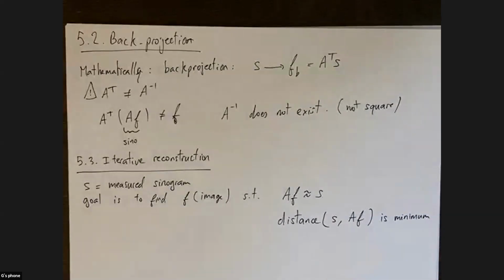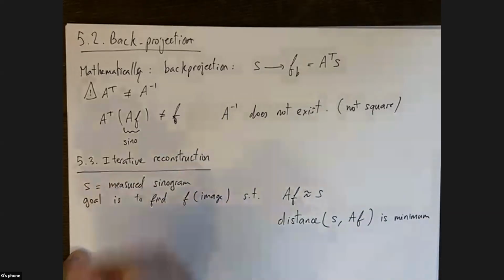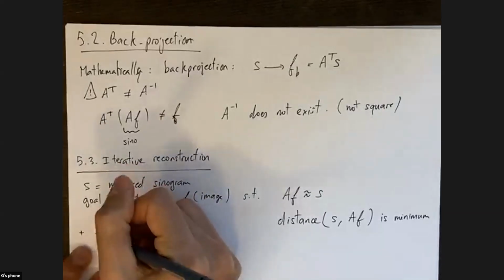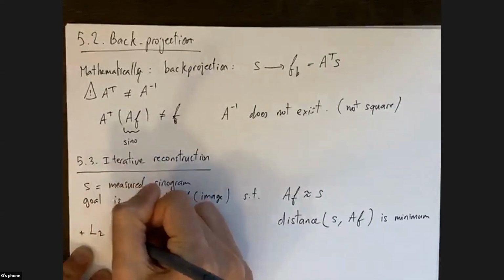So think of it as a kind of geometrical distance. It could be the Euclidean distance, or different ways of comparing whether two vectors are the same or not. What's the distance between those two vectors? So the question is, what distance to use? We're going to briefly talk about two different distances. One is called the Euclidean distance, L2.